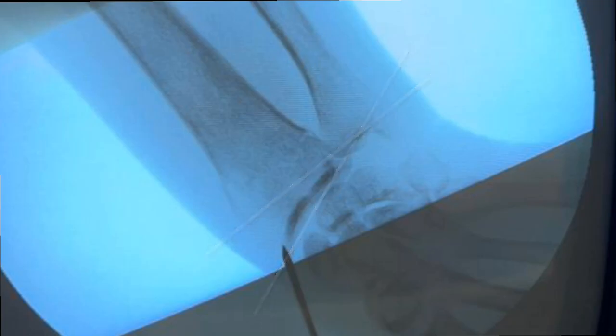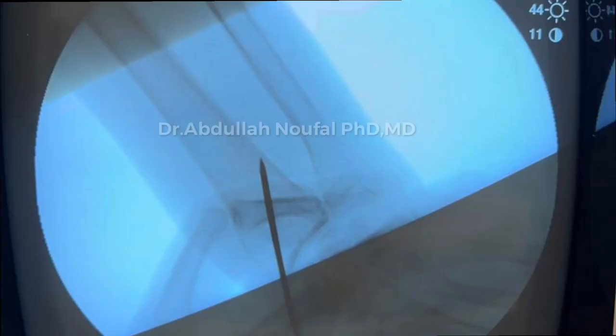In the case of simple fractures like these, it's enough to use two 1.6 to 2 mm K-wires, one lateral and one medial. The lateral one is usually inserted from the tip of the radial styloid, and it's better to be central in the lateral view to reach and penetrate the medial cortex.